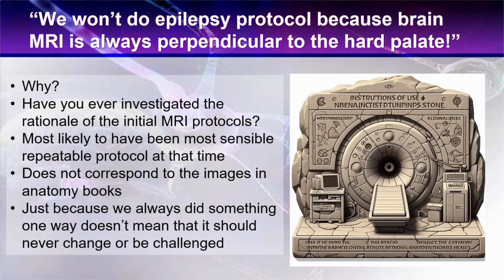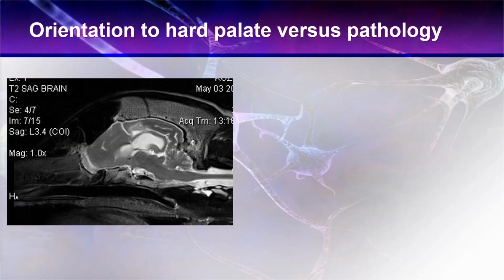And also, I find it less confusing to find certain anatomical features, probably because the MRI atlases are available now, especially online, but our original anatomy books don't correspond with the anatomy at all. So this is an example of an epileptic golden retriever. It's having an MRI scan.